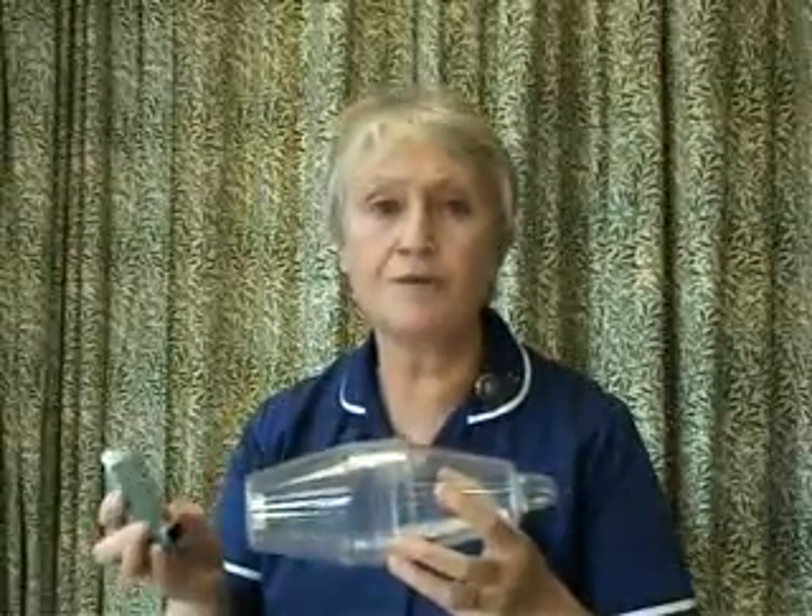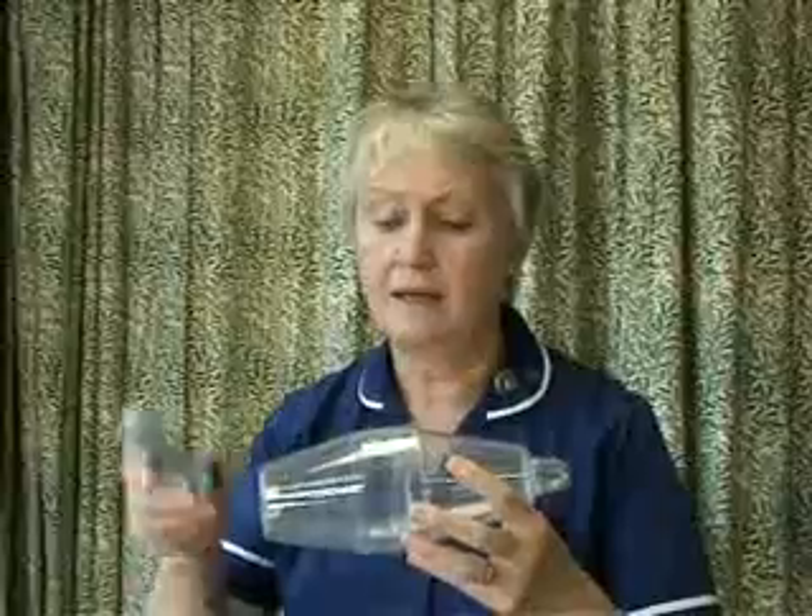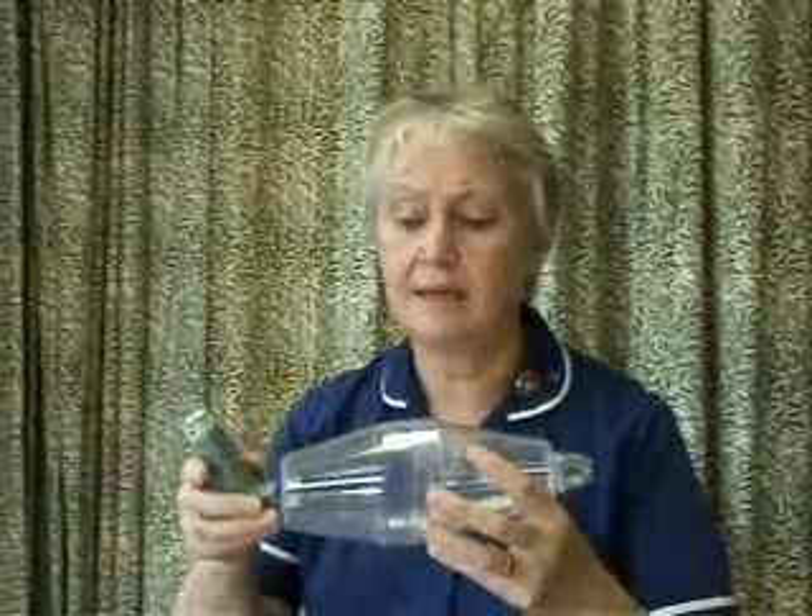This is a volumatic. To use it, you remove the cap of your inhaler, shake it gently, and insert it into the device.